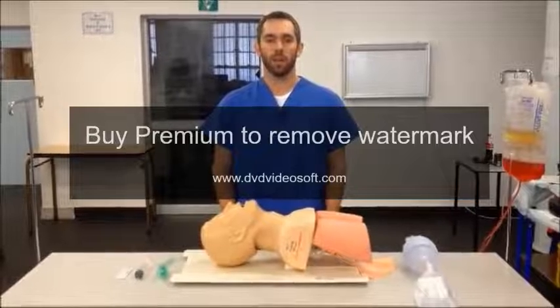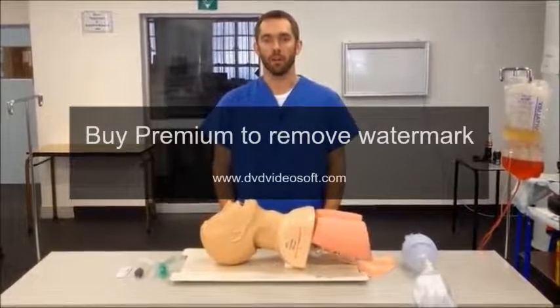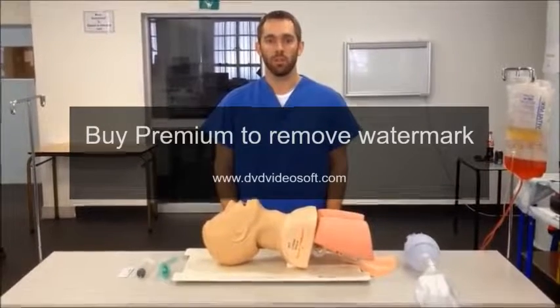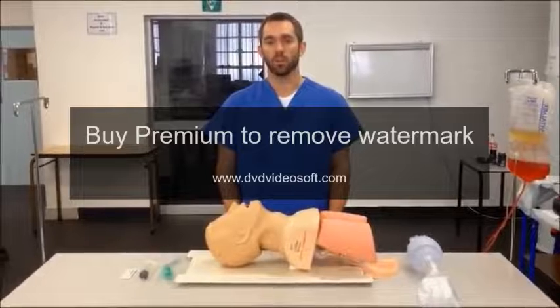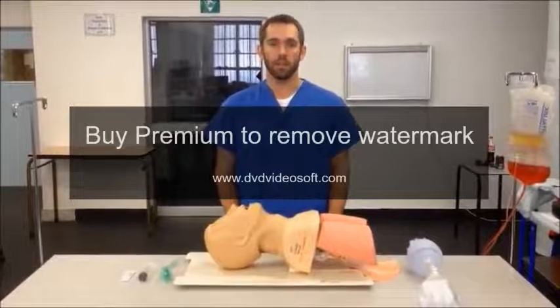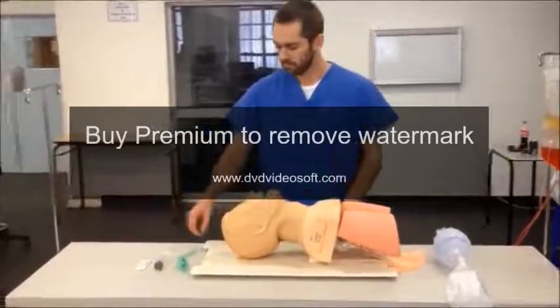Today talking about correct insertion and use of a laryngeal mask airway, or LMA. An LMA is a supraglottic airway that can be used for the non-definitive management of the airway or as part of a difficult airway management algorithm. The first step in using an LMA correctly is to select the correct size.